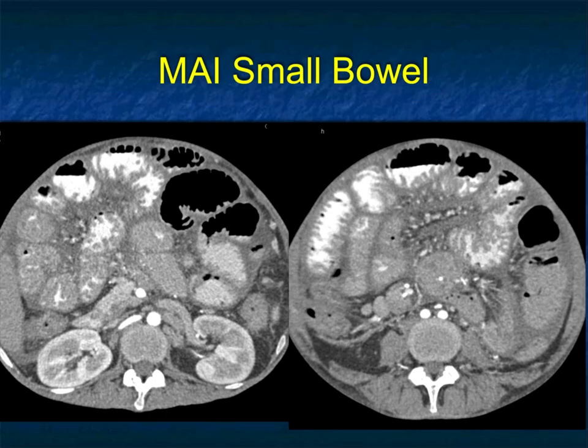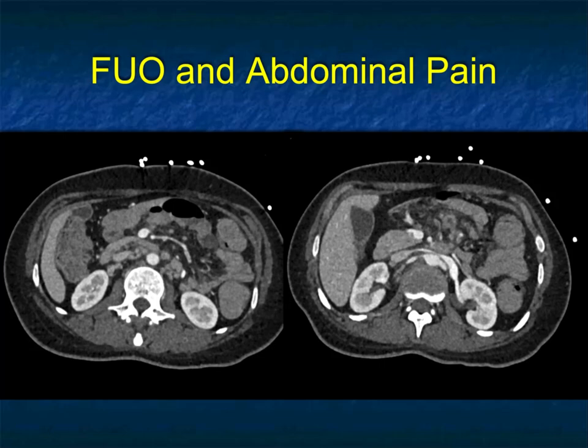MAI in the right population — usually HIV or AIDS patients — you're thinking about MAI. MAI gives you mesenteric nodal masses. Often the nodes are of low CT attenuation; that can be helpful. Here it's not really low attenuation unless you have a vivid imagination, but MAI is a possibility and something to think about.